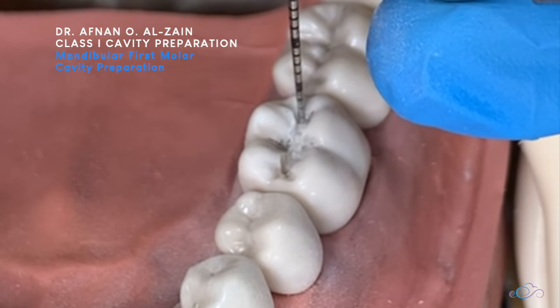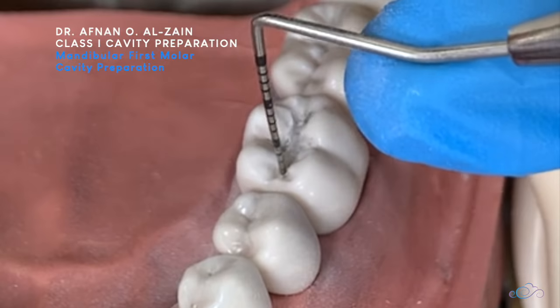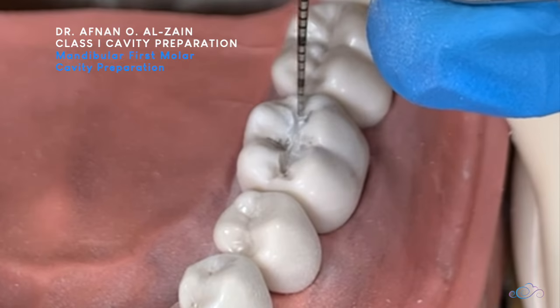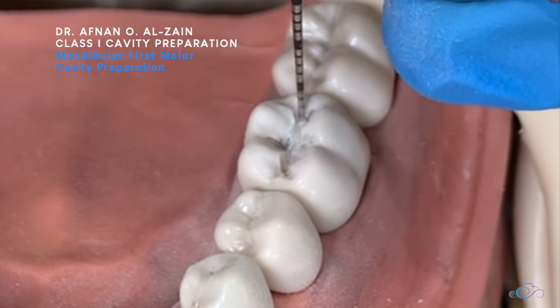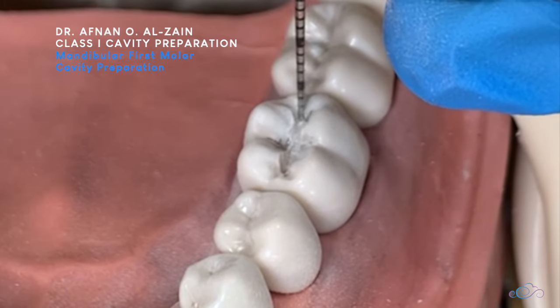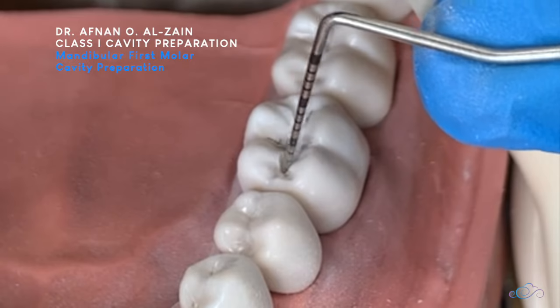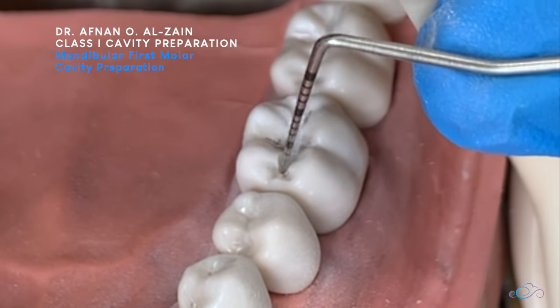Let's check the peri-probe and then we'll check the depth. The depth is 1.5 to 2 mm. It's 2 mm depth in total for amalgam cavity preparation, and for composite it's 1.5 mm. So we can see here when we measure the depth.